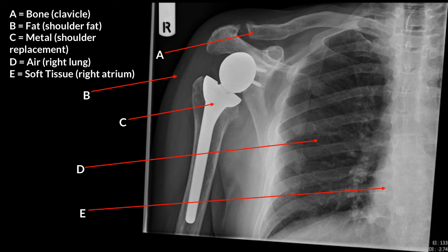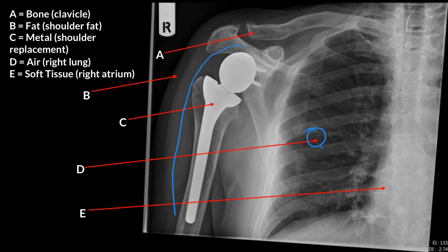Here is a right shoulder X-ray that also includes the right lung fields. The air in the right lung field appears the darkest because it is the least dense object. The bright white object is a metallic right shoulder replacement — it appears brighter white than the surrounding bone because the metallic implant is even more dense than bone, so fewer X-rays pass through it.